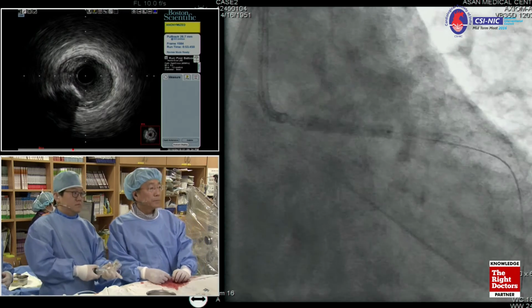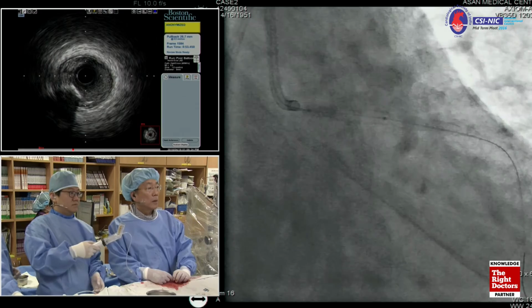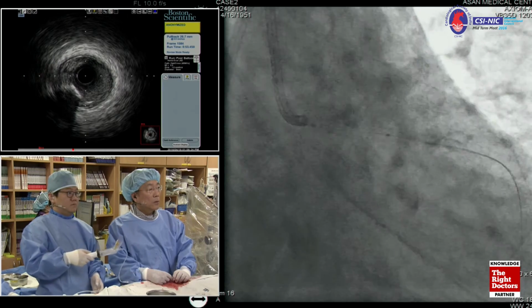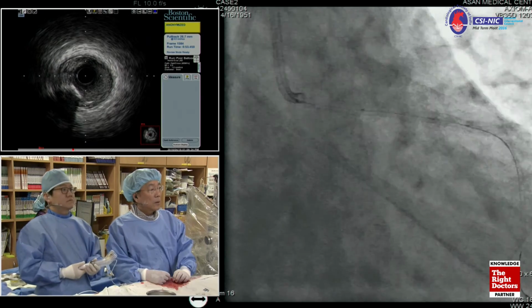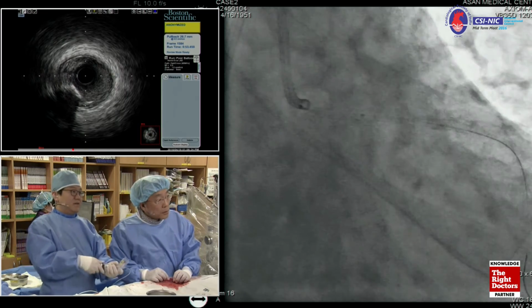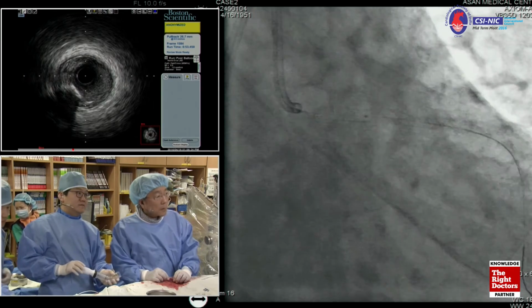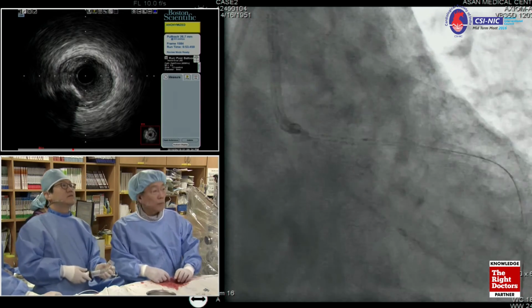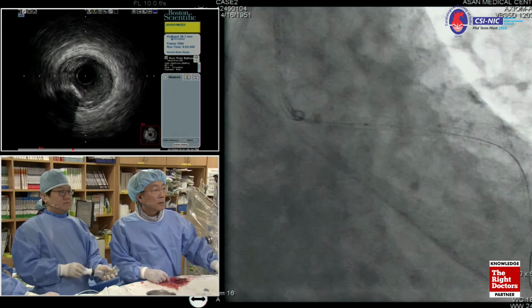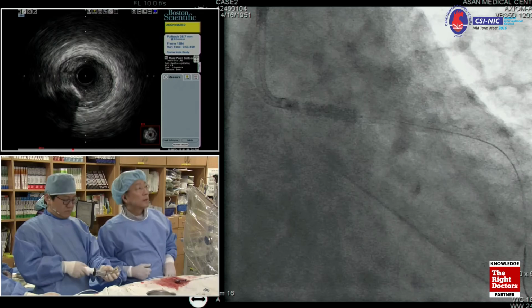And then you're going to do high pressure. This is circumflex. I think we're still running out. There must be some overlap. Just a minute. Yes, we're running out of satellite time. All right. We'll probably be with you another few minutes, so we'll stay with you till you finish as much as we can.